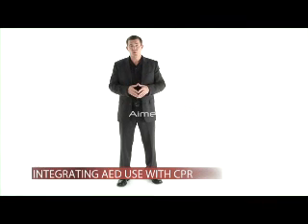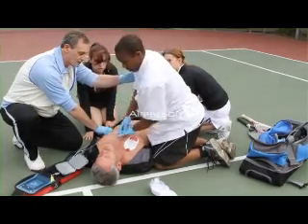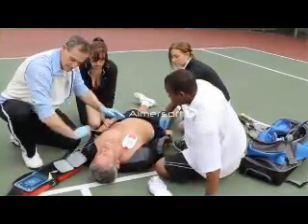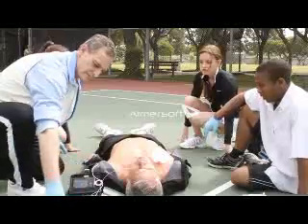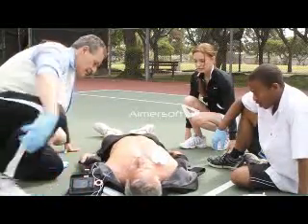The lone rescuer will have to stop CPR to apply the pads and use the AED. If a second rescuer is available, they turn on the AED and connect the pads while the first rescuer performs CPR. The AED will automatically analyze for a shockable rhythm every 2 minutes. Rescuers should switch roles each time the AED prompts them to stop CPR. Immediately resume compressions after the shock.